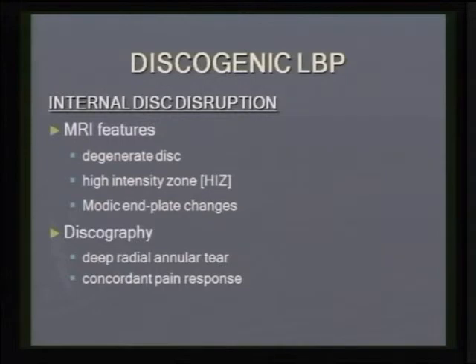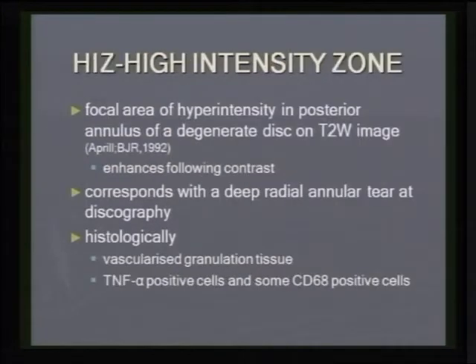And on discography, we will identify in the positive cases a deep radial annular tear, and the patient will show concordant pain response on injection of the disc. So we start by talking about the high intensity zone.